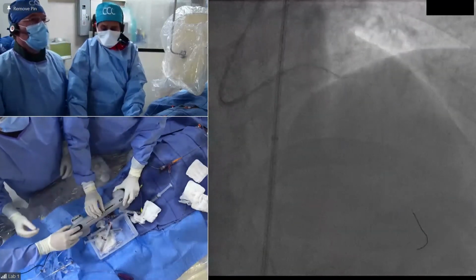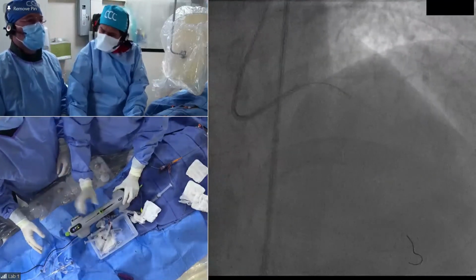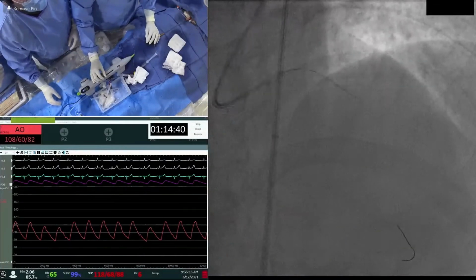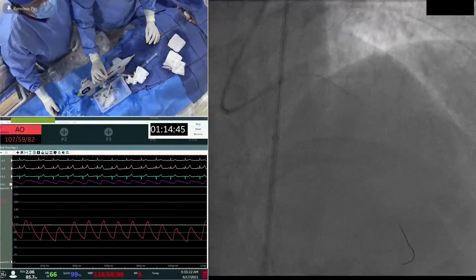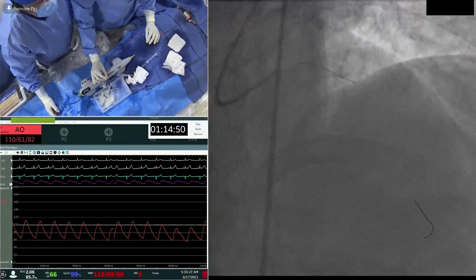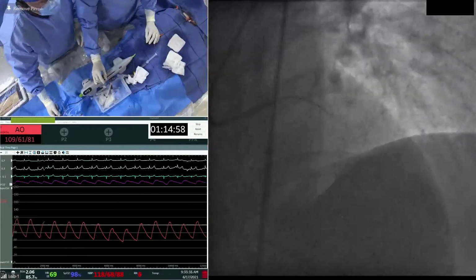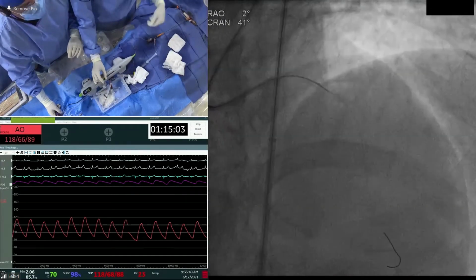No. Yeah, I think in our lab, we're very proactive about use of atherectomy. I'd love to hear from Holger. I know that in Germany, you guys are not so into atherectomy, or maybe you are. I don't know. Tell us. Yeah, no, we are also active with atherectomy, but we are mainly using rotablation because we currently still do not have the orbital atherectomy in Germany. So it's one of the few things where the Americans are faster than the Europeans. I'm kidding. Probably for this patient, we would also go for rotablation.